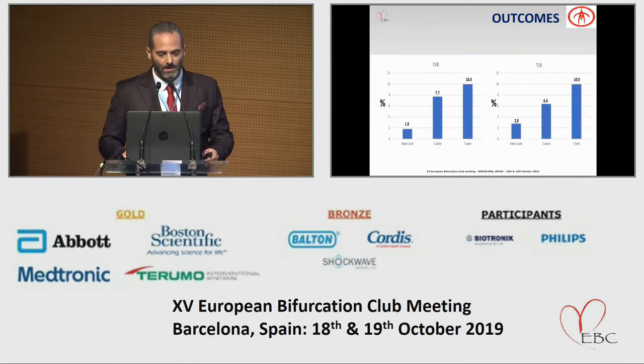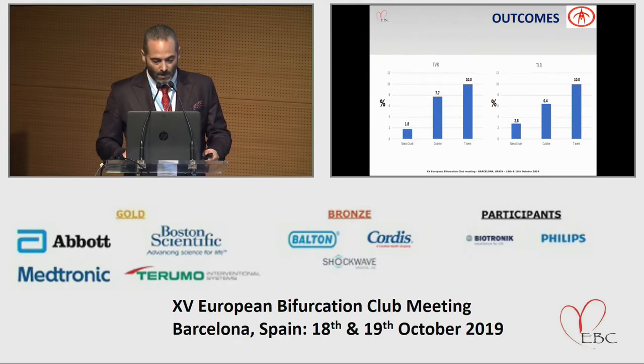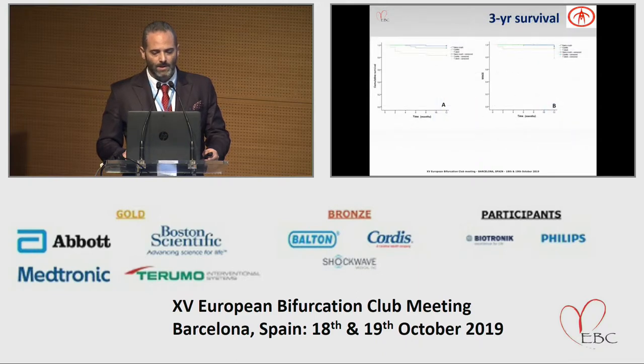The outcomes, TVR and TLR, were much in favor of our technique compared to the others. And one year survival was in favor of nano crush. Now we have 250 patients enrolled in a multicenter registry of unprotected left main at 3 years of follow up, and the results are exactly the same.